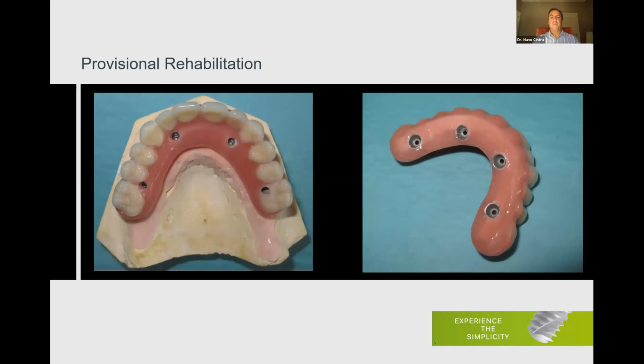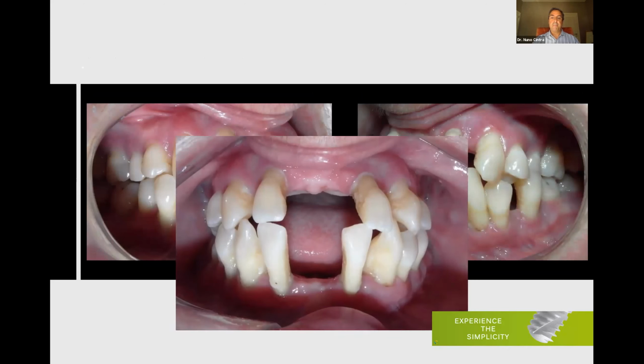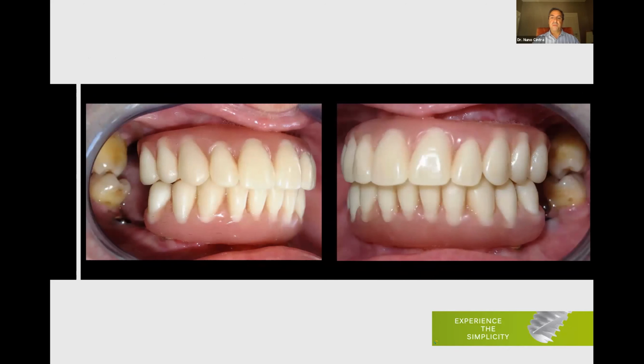Provisionals. I said that I was not talking about prosthodontics, but at the end of the day, after surgery, we deliver a full acrylic provisional prosthesis fixed to the patient. That's the protocol. And this full acrylic bridge has 10 teeth or 12 teeth, depending on where the implants are coming out. So we can go from a situation like this one to a situation like this.